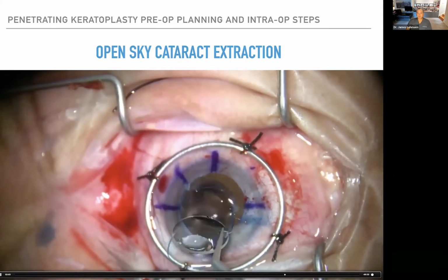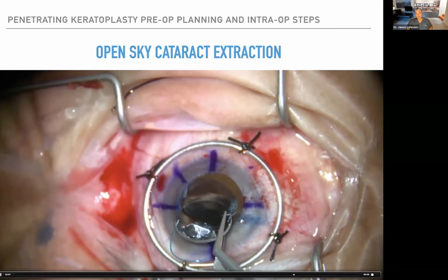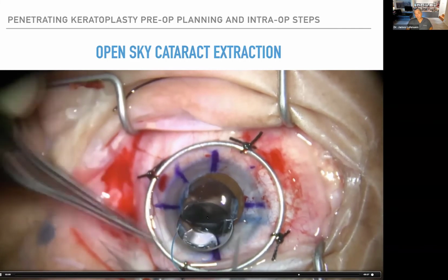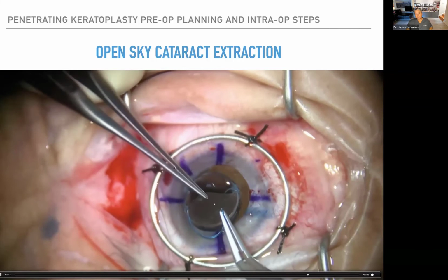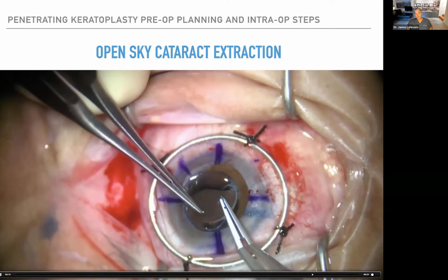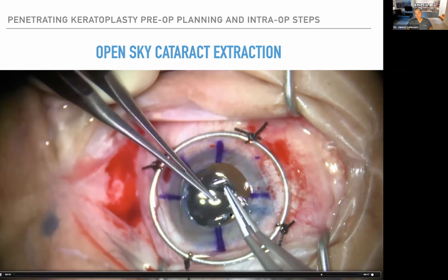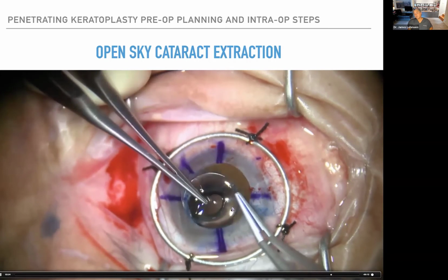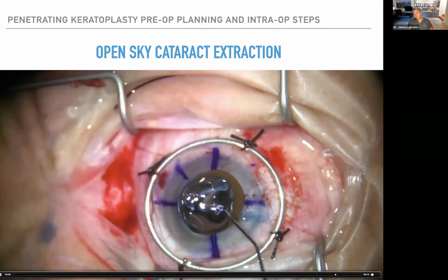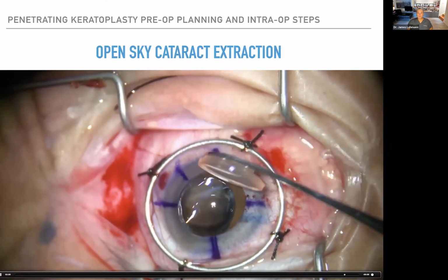And then here I'm inserting a 3-piece IOL. And so I put some viscoelastic. This is tricky, no doubt about it, because there's posterior pressure. This is not a deep bag. This is the move right here. You have to have the haptic, and you've got to use your other hand to push posteriorly, and you've got to tuck that haptic under the iris and then release. So it's a pronation of your hand, torquing the haptic a little bit, pushing posteriorly, and then releasing so that it flies underneath. And now here we're putting the cornea on.